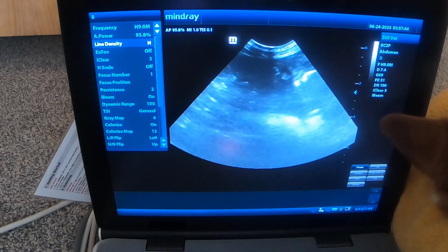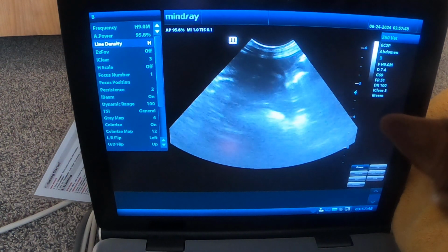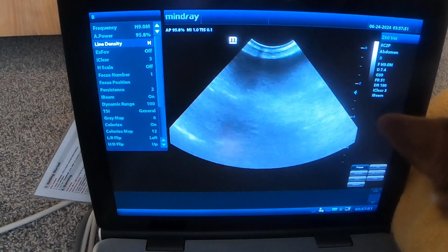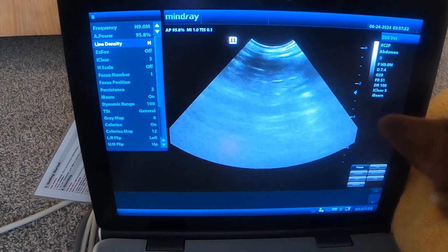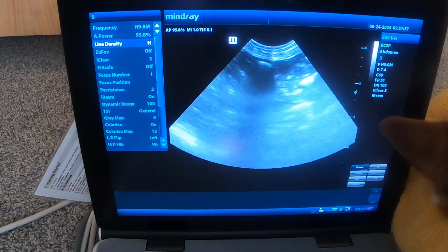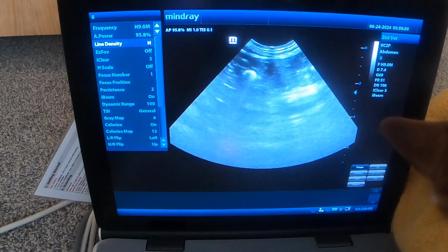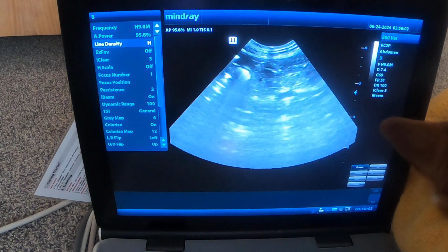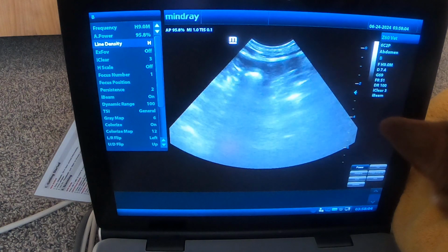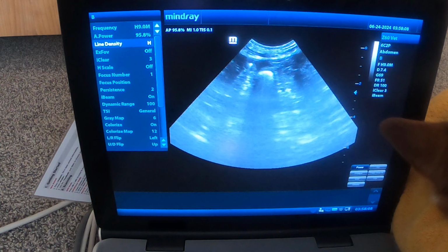Finding the gallbladder, we know that sits between the right middle and quadrate lobes of the liver, so I can aim the probe just a little bit to the right-hand side to find it. That'll give me a good view. The bladder should be right about midline. Find the bladder, find the colon adjacent to it, and then put the probe all the way up underneath their ribs while they're lying down, aiming underneath the ribs again to see the liver, find that right kidney, and make sure we're in the right location.